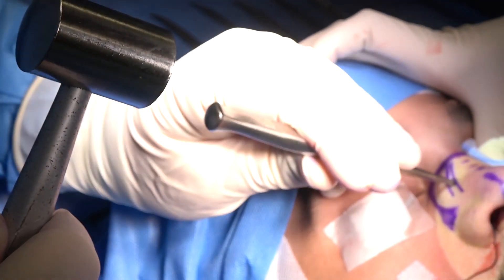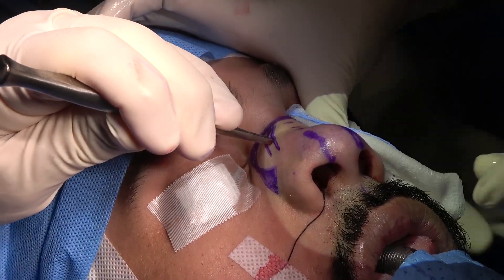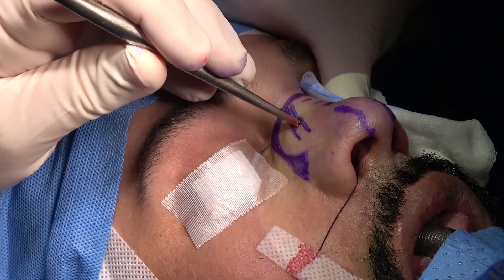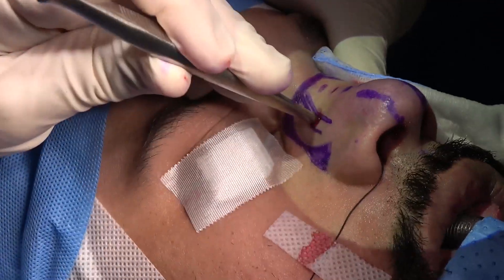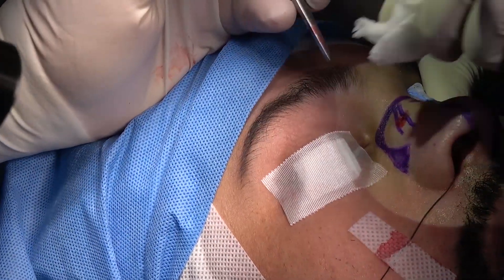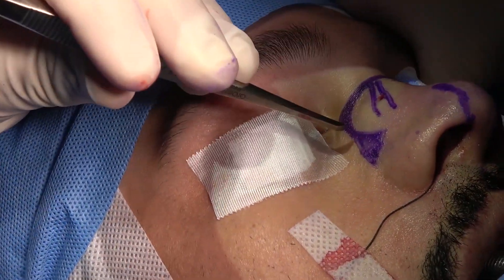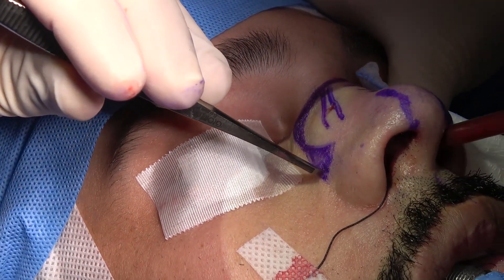No much bleeding. Good preparation — thank you to the anesthetist for her good sedation and stabilizing the patient. Again, upper mid-lateral, going through the skin, the periosteum, the bone, but not through the endosteum and the mucosa. Lower mid-lateral now, going two millimeters below. So we have now the double mid-lateral — upper and lower — and now the lateral osteotomy, transforming the osteotomy from horizontal to vertical, and preserving this portion of bone.